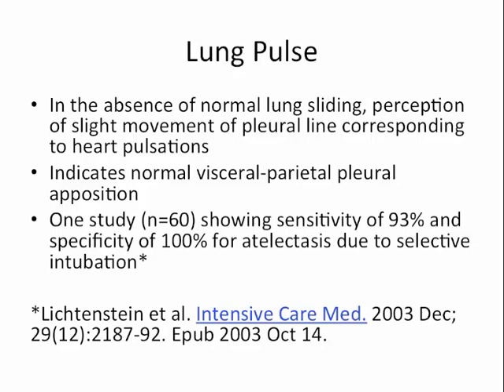Another sign that can help you assess a patient with loss of lung sliding is the lung pulse. The original study found it had a sensitivity of 93% and a specificity of 100% for selective intubation causing atelectasis. With this sign, you see no lung sliding with respiratory movement, but instead a slight shimmer that corresponds with heart pulsations, indicating a healthy visceral-parietal pleural interface. The lung is not moving with respiratory movement — you're just getting transmitted heart pulses causing slight movement of the pleura.